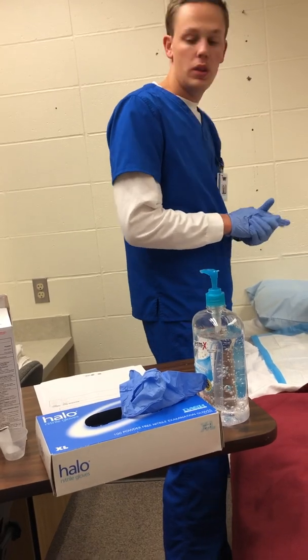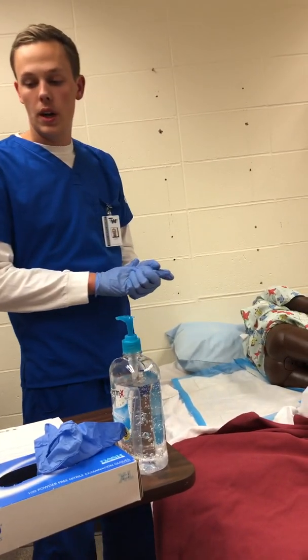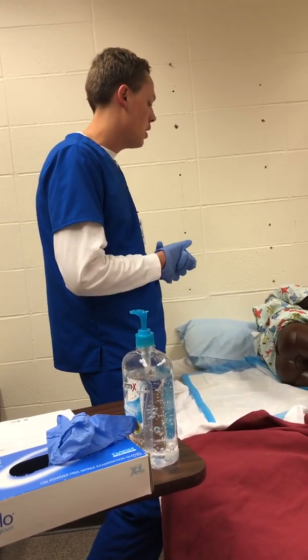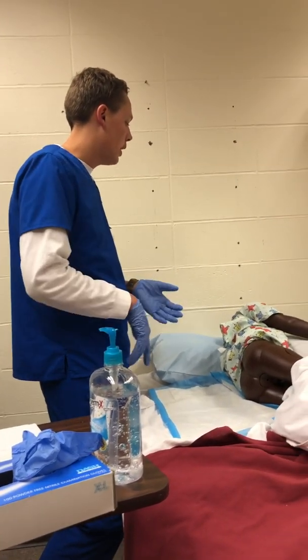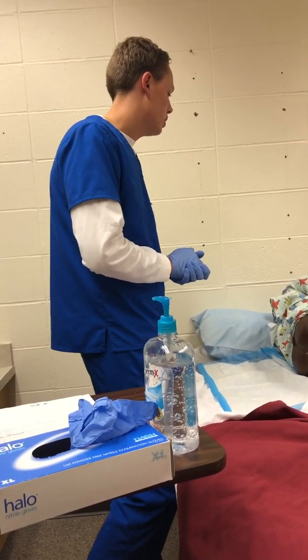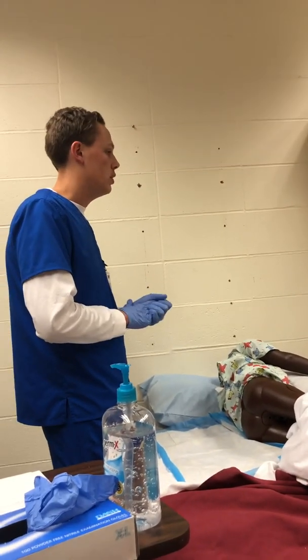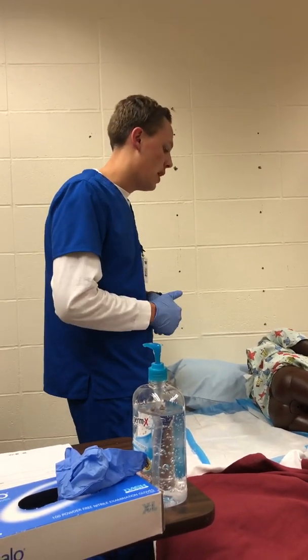So we're just going to put you back into the left Sims position. We're going to have this enema warmed up. It's going to be a lube tip, and we're going to inhale and then have you relax your sphincter. Once you exhale, I will insert it and slowly push the fluid in. I'll have you hold it for as long as possible, or upwards to 30 minutes, and then once you're able to defecate, you'll be able to call me, and I'll either assist you to the bathroom, or if you're not able to, then we'll use a bedpan.